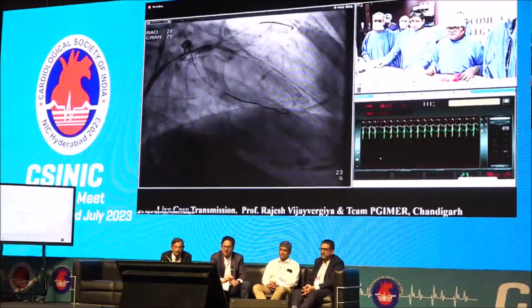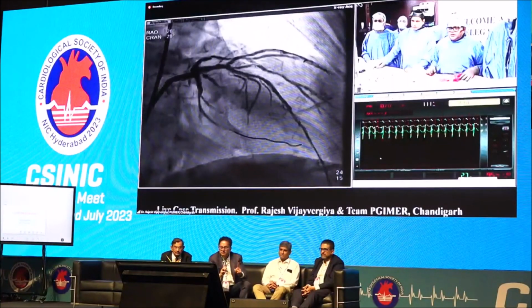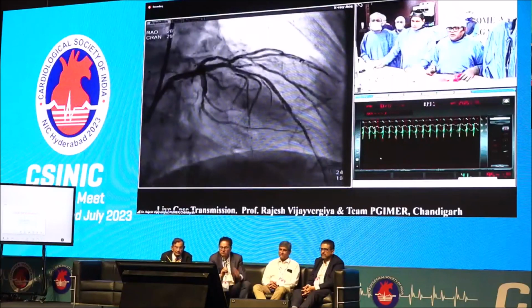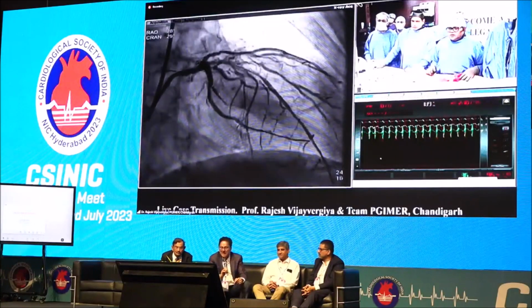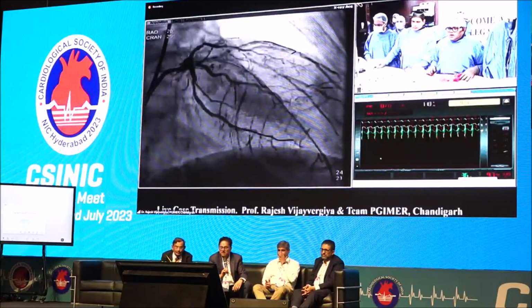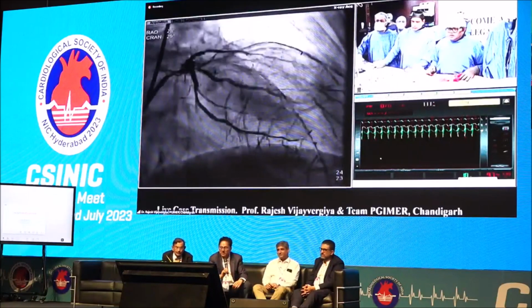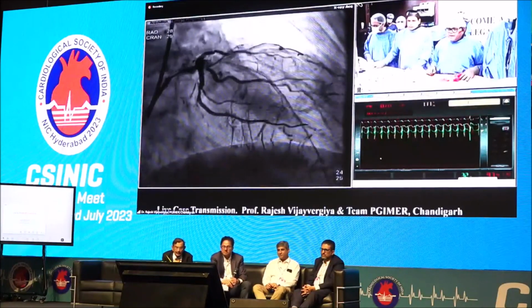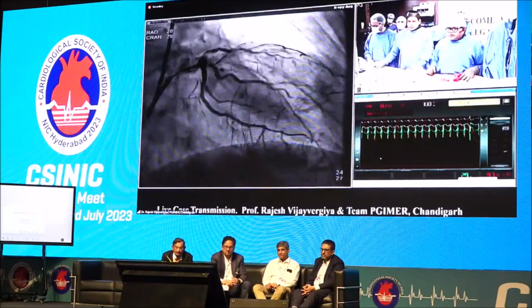Next. You know, I love the fact that you did the ballooning after the rota. Absolutely right. A lot of my colleagues will just rota and then try to stent it, and even then they can't get full expansion, and then it causes a huge mess. So always balloon before you stent. Rota balloon or rota cut, this is a very ideal indication. Okay. So it's a 2.5 distally.